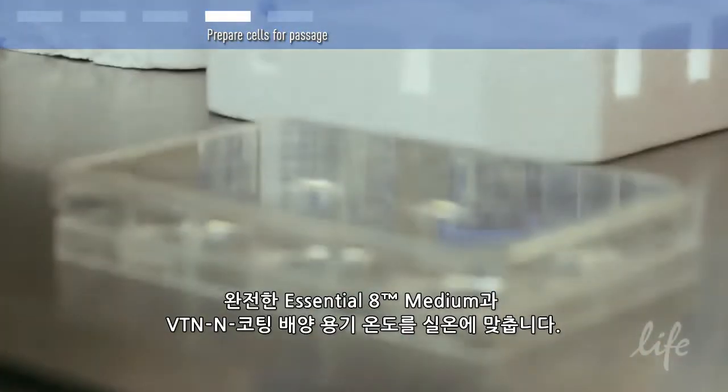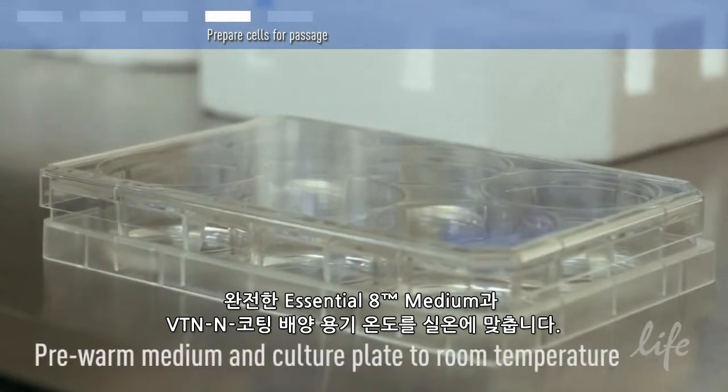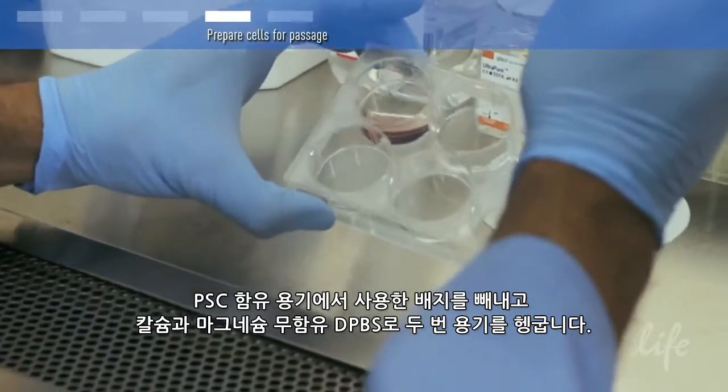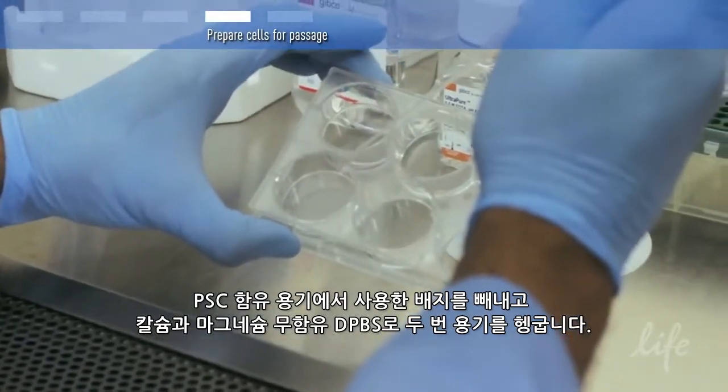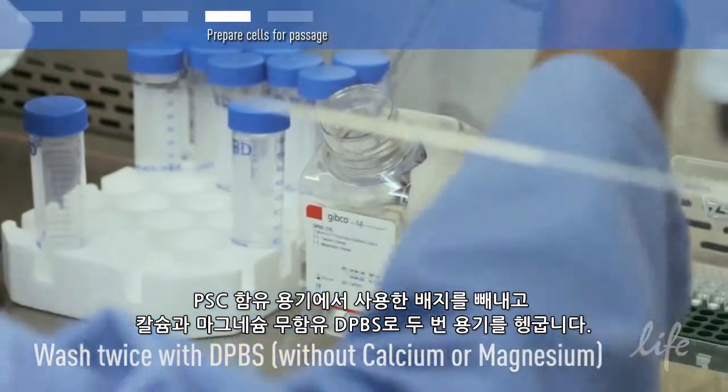Pre-warm complete Essential 8 medium and vitronectin-coated culture vessels to room temperature. Aspirate the spent medium from the vessel containing PSCs and rinse the vessel twice with DPBS without calcium and magnesium.